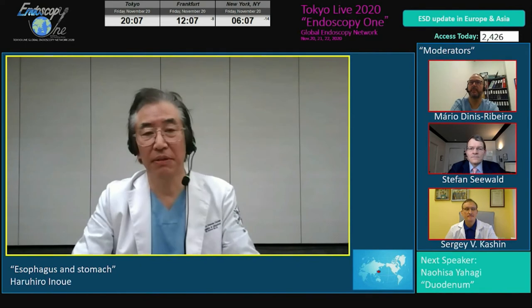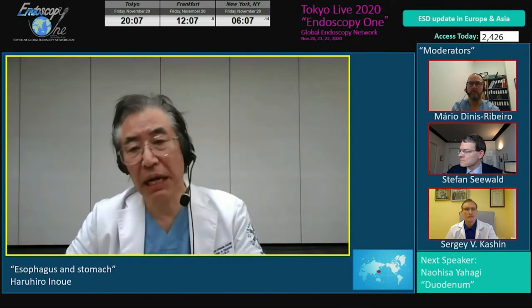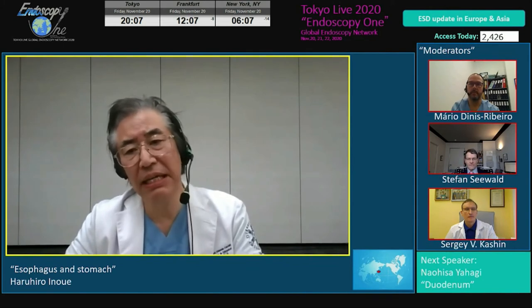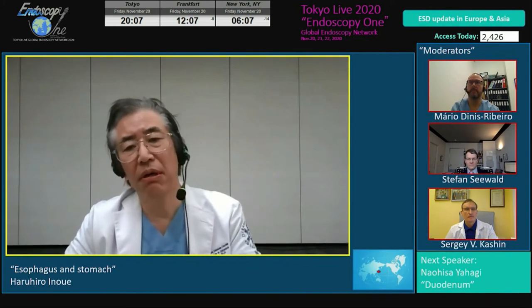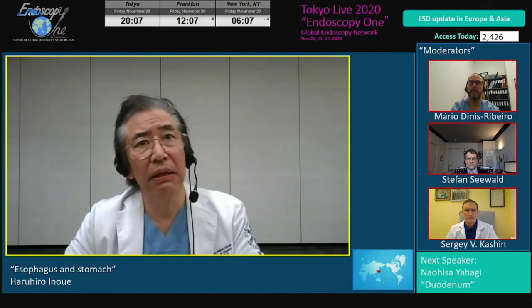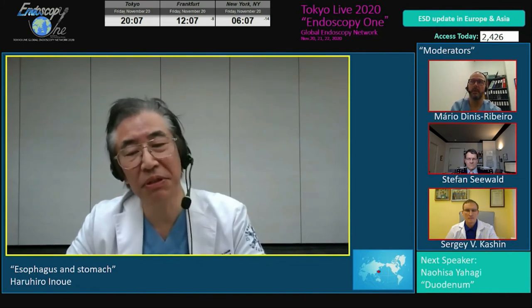Thank you very much, Mario. It's a very, very important question. I recommend the traction technique for all cases. We can accept any type of traction device. Anyway, by giving traction to the tissue, we can perform a very quick ESD, quicker ESD. And I think traction is recently the best technical advancement of ESD. So I recommend it for all.